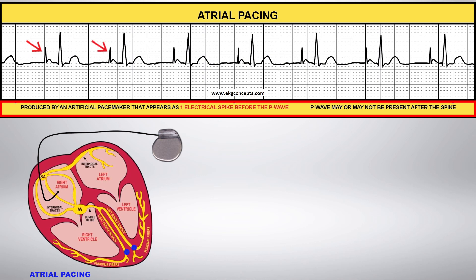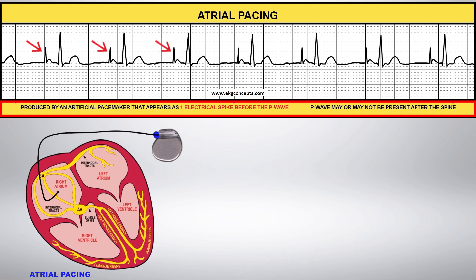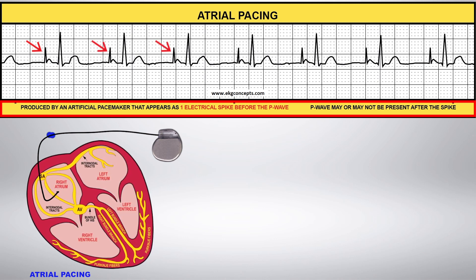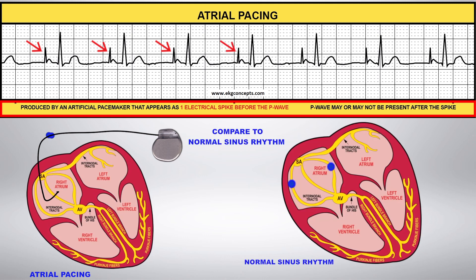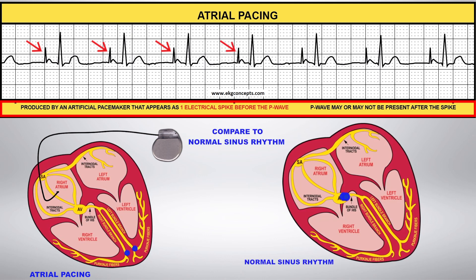Depending on where the atrial pacing lead is placed, the pacer spike may or may not be followed by a P wave.